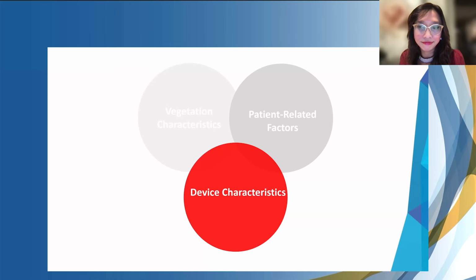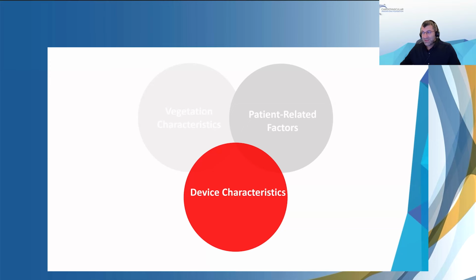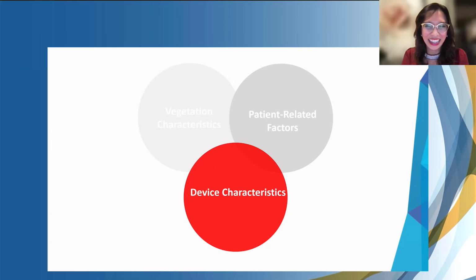So the only thing I would add, Nadira, is if you're doing AngioVac on me and putting a 26 in my neck, please put me out. General anesthesia, TE.